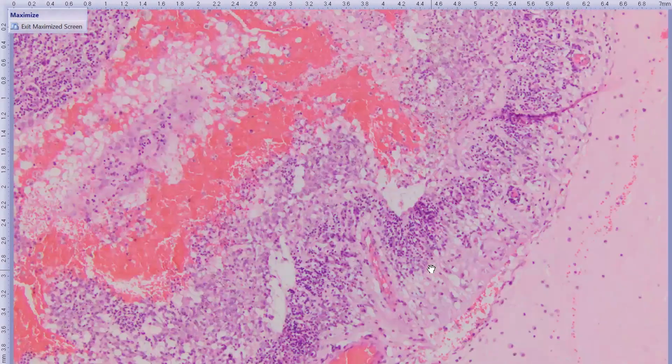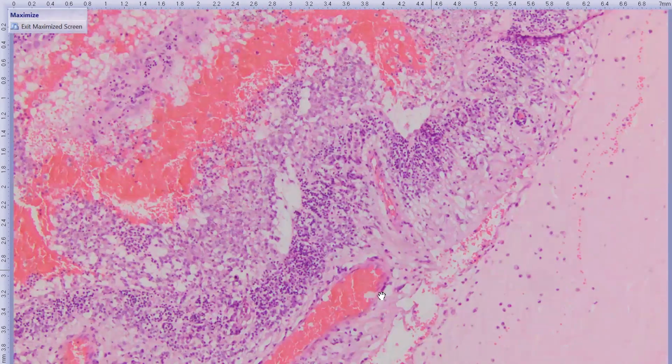All right. So we have the retina, which is detached. We have an outer retinal atrophy. And then beneath the retina, so subretinally, we have inflammatory exudate. And that is mostly composed of these large plump macrophages and some neutrophils. So we have a pyogranulomatous endophthalmitis, which is particularly oriented subretinally.